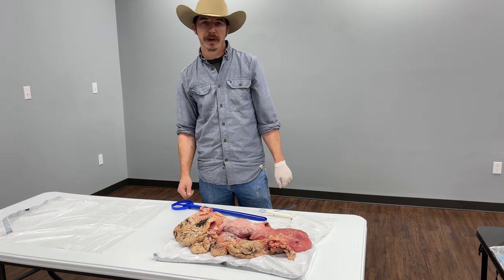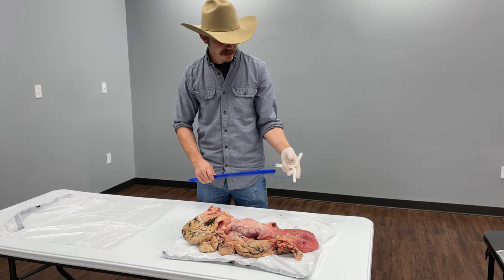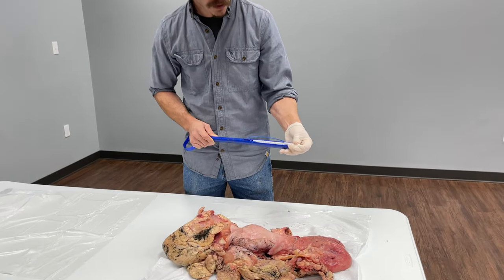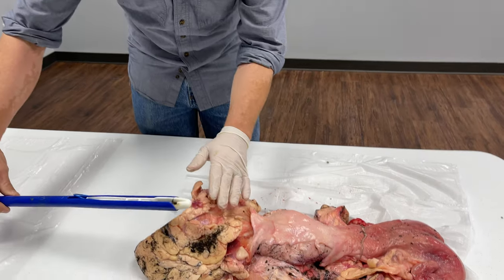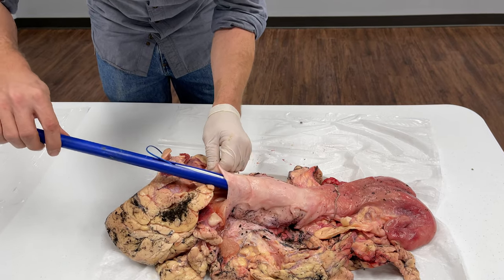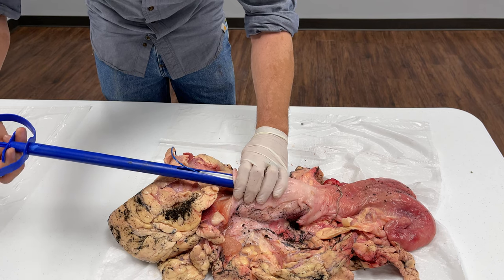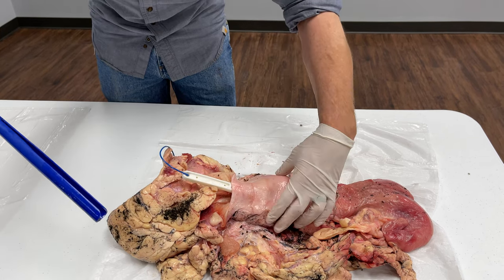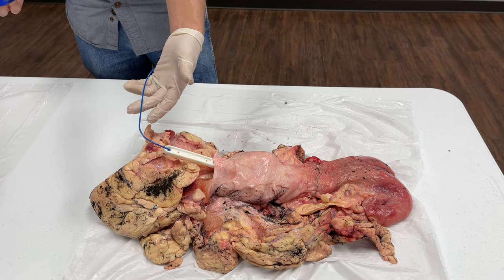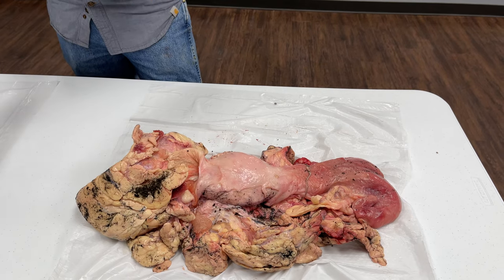From a standpoint of putting a seeder in on a tract like this, you would enter the vulva, go through the vaginal canal, and you'll feel it stop when it hits the cervix. You release the seeder, and those wings fold out — that's what holds it in place. Once the seven-day protocol is up, or five-day for heifers, you go back, grab the string, and pull it out.